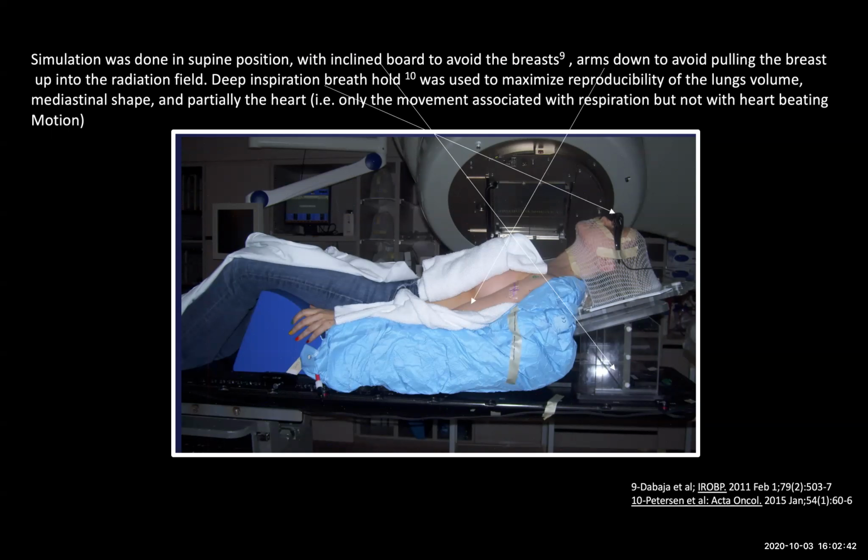And because you want to make sure not to collide with the table whenever the gantry goes posteriorly, you make sure, one, to put the isocenter very posterior, and second, to put a face mask on that patient to move their mandible away from the entrance of the beam that is going to be closer to the mandible since the patient is on an inclined board.